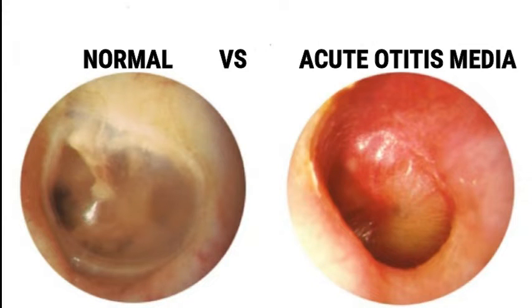In this video, I'm going to be going over normal ear versus an ear infection. At the end of the video, we'll say other conditions you could see while looking into someone's ear. So let's get started. First of all, ears are a little bit hard just because when you look into someone's ear, not every ear is going to look the same. And in order to know what is abnormal, you have to know what's normal.